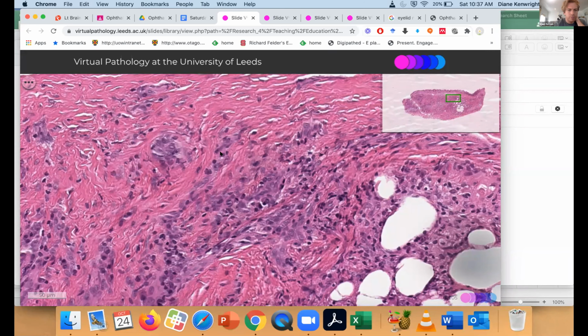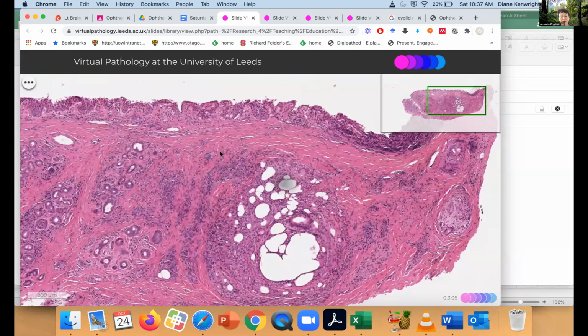Cool, thank you. So although it's a mixed inflammatory population, I wouldn't describe them as pleomorphic cells. It's pleomorphic in that there is a variety of different cell types, but describing this as pleomorphic would lead you down the wrong pathway.